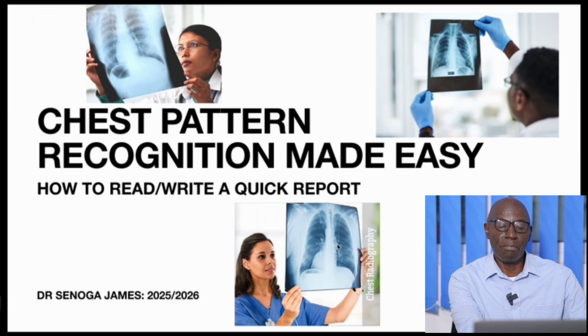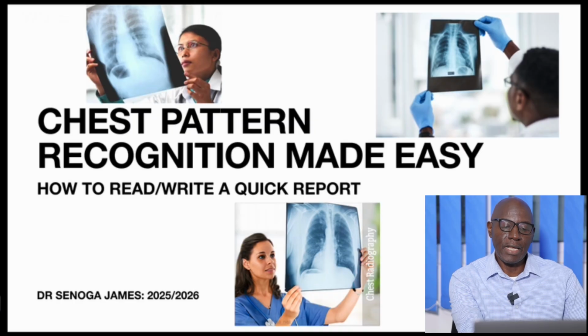People put it up, and one of them is even putting it the other way around. Everyone wants to get some information from an X-ray. You go to the hospital, the doctor does the X-ray and gives it to you, and sometimes it is very confusing for the patients, but to my radiographers and the radiology imaging technologists, this is a must nowadays.